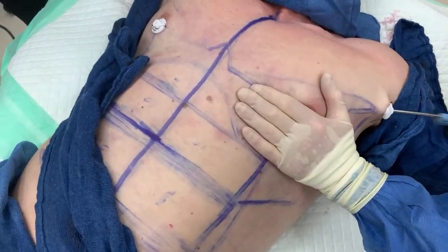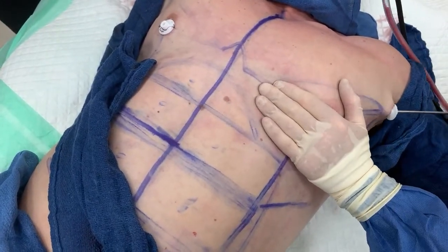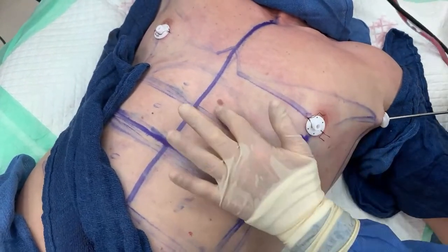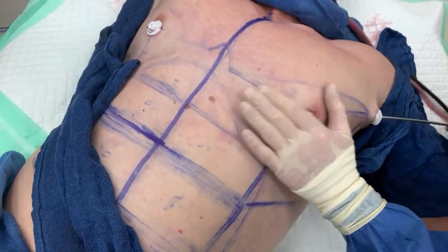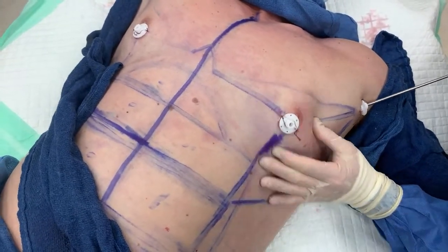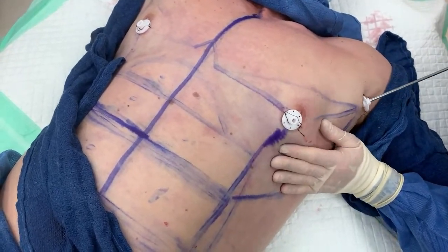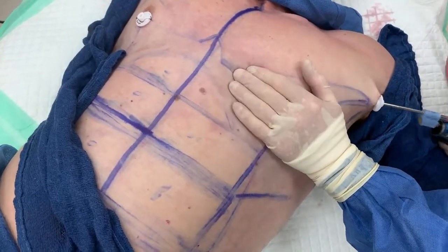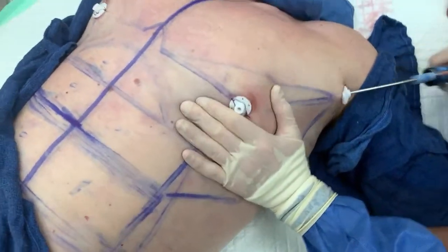So I've hydro-bisected the gland from the muscle, vasored it and melted it. You can bring the machine up closer a little bit to the vasor. I don't want to suction on the six-pack yet — I want to isolate those and then I can whittle them down if I think they're too dramatic. Now I can feel where that gland is — I'm getting like a rock and I can scoop under it. Like you're digging a rock, planting a tree, and you find a big rock there.